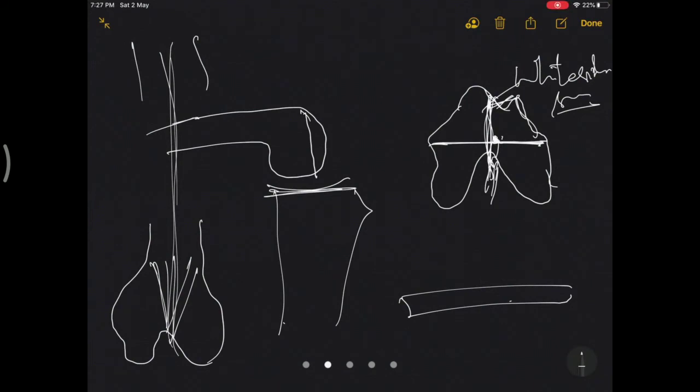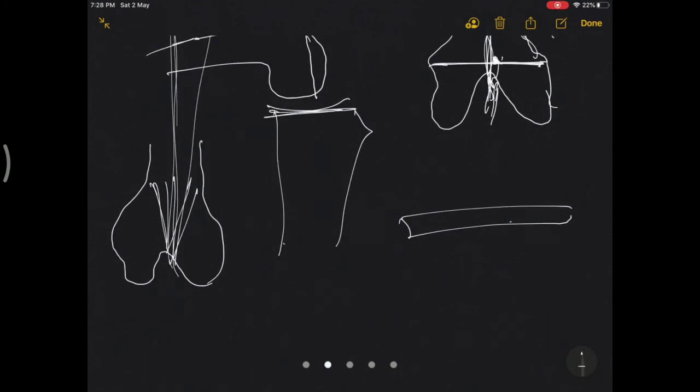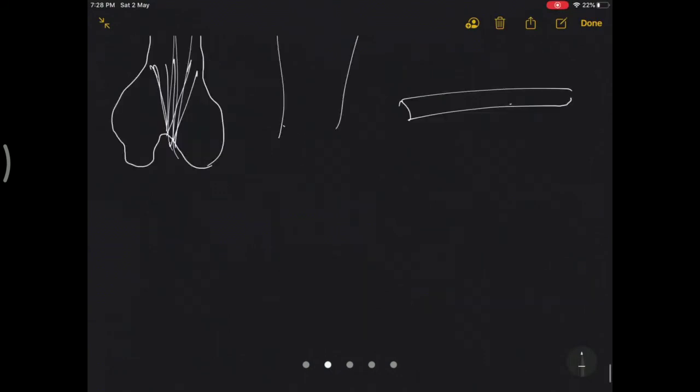As you know, the anatomical axis is 6 degrees valgus to the mechanical axis, and now we are dealing with something to align our cuts perpendicular to the mechanical axis, since we are dealing with mechanical alignment. So the next cutting jig comes like this.